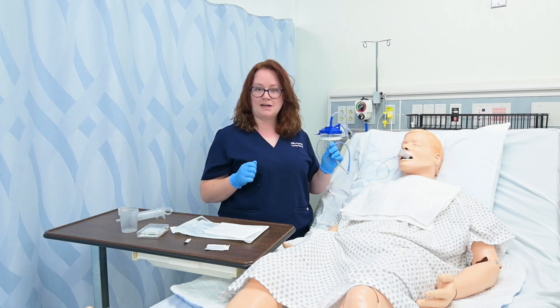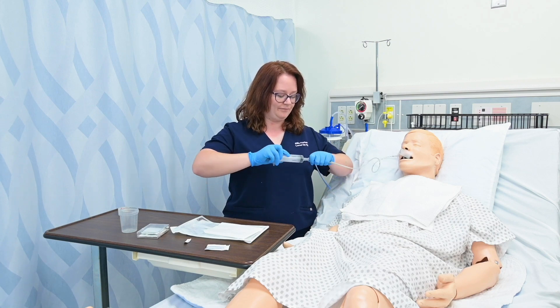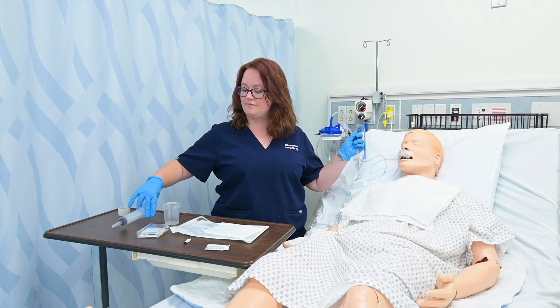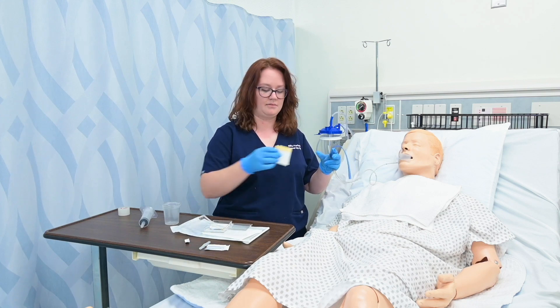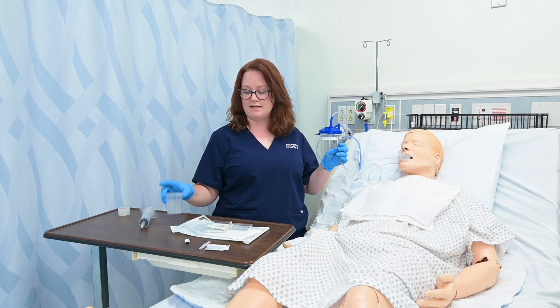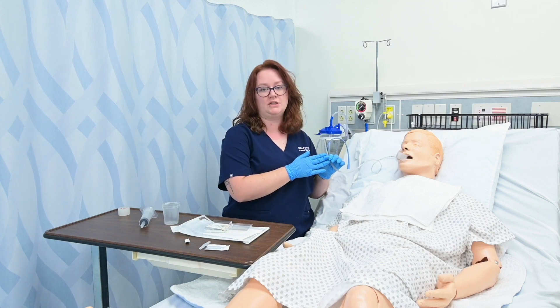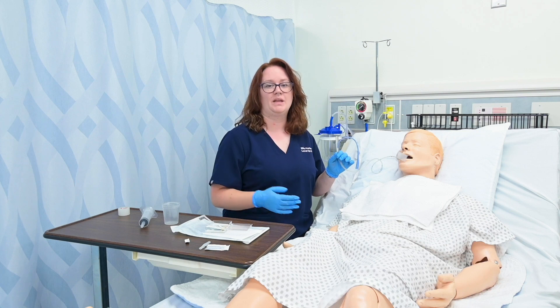While it's secured, I want to double check that this is in their stomach. The best way to do that is to use my piston syringe, withdraw some of the gastric secretions, drop them into my cup, take one of my pH sticks, dip it in, and the pH stick will indicate the number. It needs to be less than five for me to feel comfortable that it's in the correct spot. I will also note that an x-ray is the gold standard — especially if I'm going to use this NG tube to insert anything like medication or tube feeding, we need an x-ray to make sure we're in the stomach and not somewhere else like the lung.